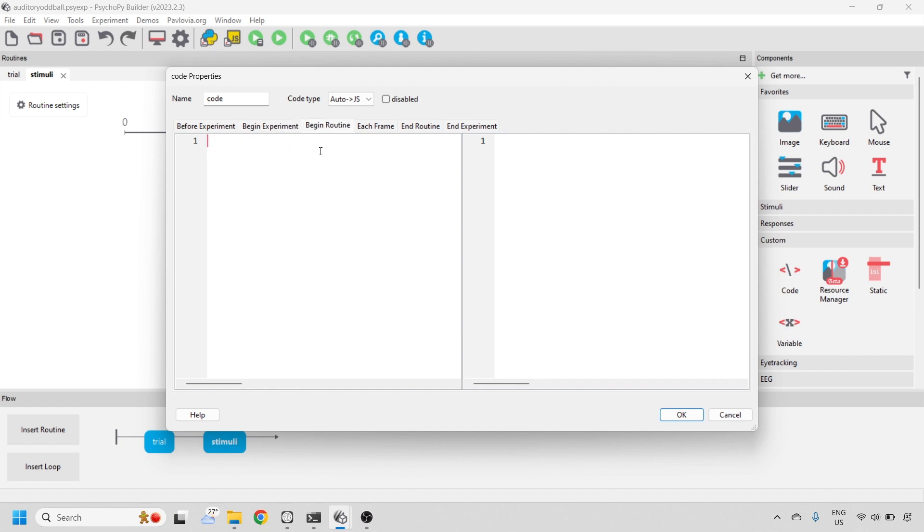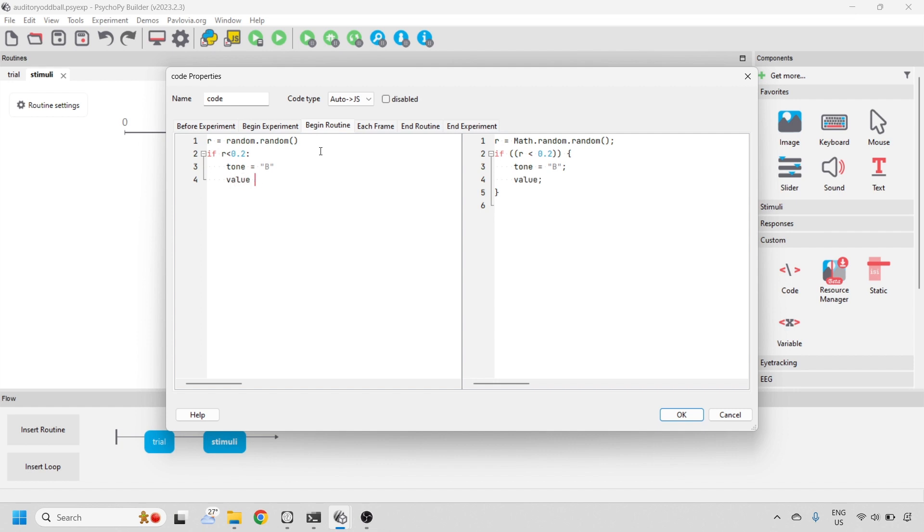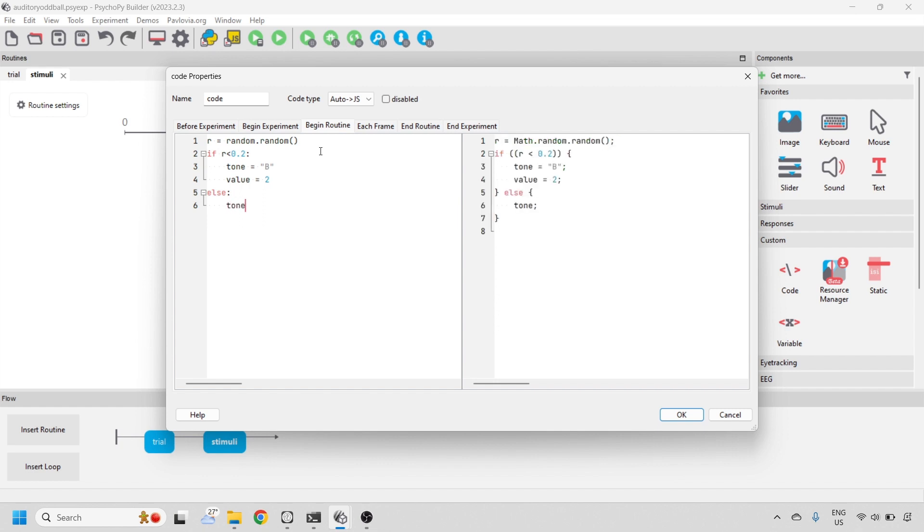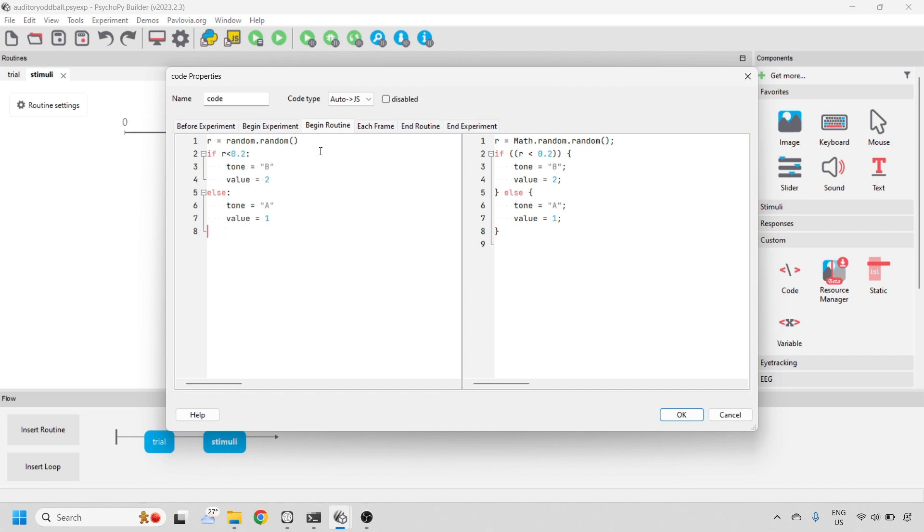In the begin routine tab, let's define a random variable. We'll use this random variable to deliver a high tone every 20% of the time with a marker value of 2. And all other times, that's 80% of the time, we'll deliver a tone that's a low tone with a marker value of 1.